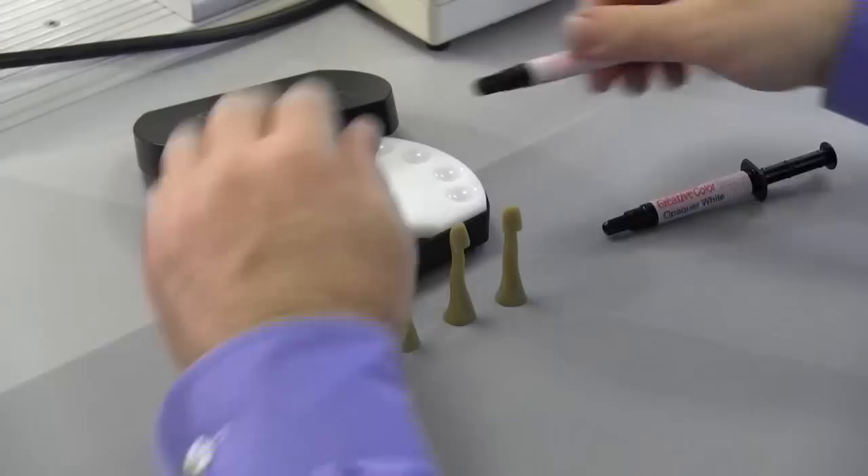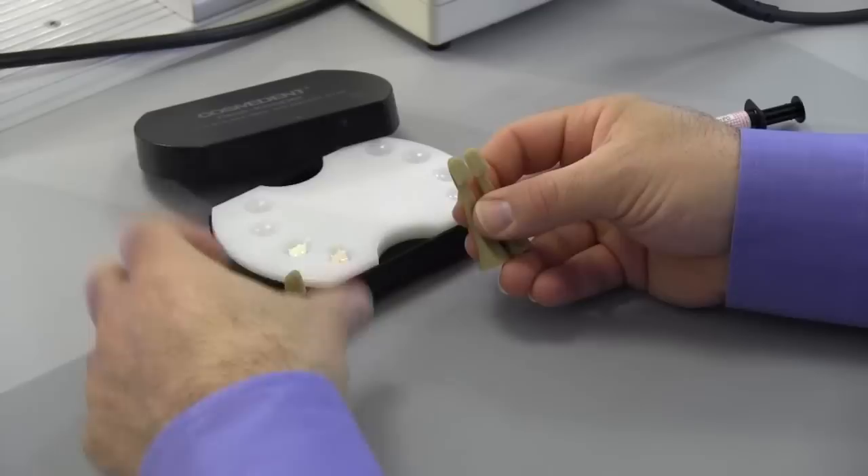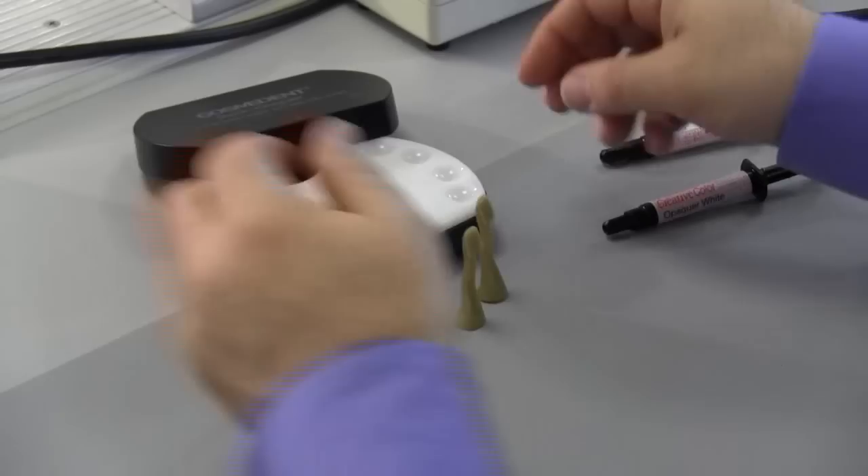Next we're going to take our shade guide formers. We have three shade guide formers that are all C4-based. We're going to use two of those and hold one out as our control, and we're going to take our white opaque first.